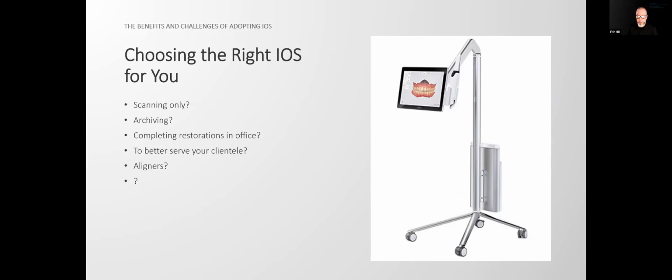Secondarily, if you use something like Medit, which is a great scanner in its own right, it is very advanced on the back end because you can install a million apps, and you can even do some design with that software. So in some scenarios, that is great for folks that like to do things in their office. In other scenarios, it can be very overwhelming on the screen, and you might not want any of that information. So you might purchase something like a Medit based on the good reputation, and then get to a point where the scan software itself is a little bit too confusing simply because there's so many options on the screen.